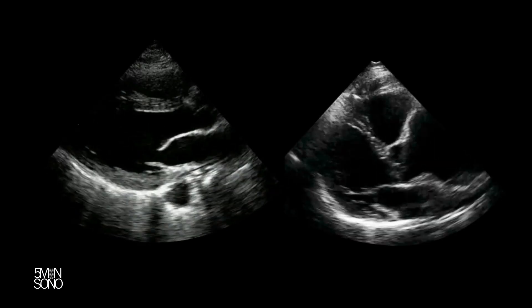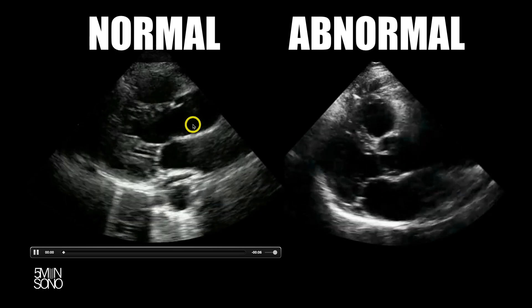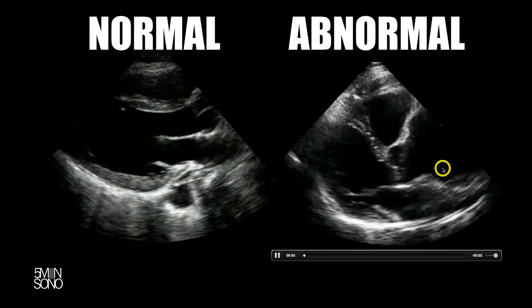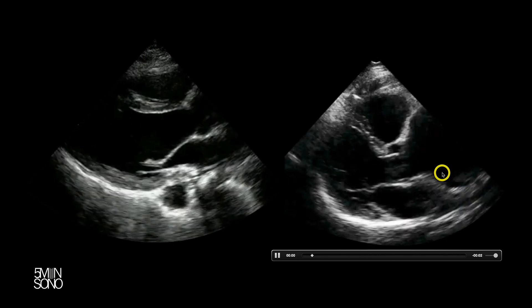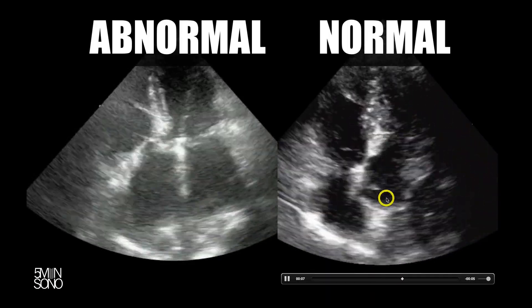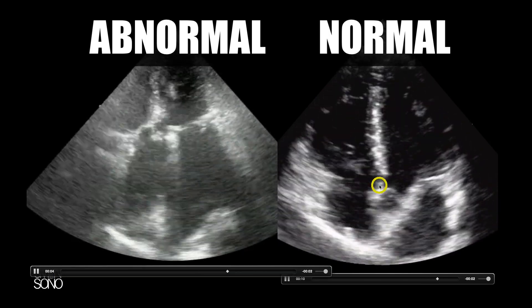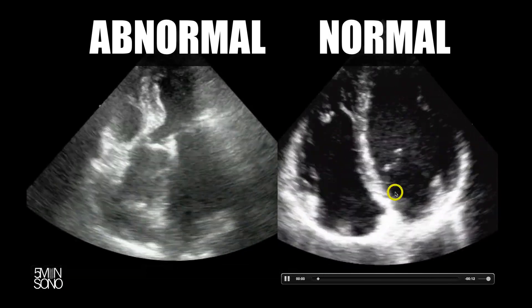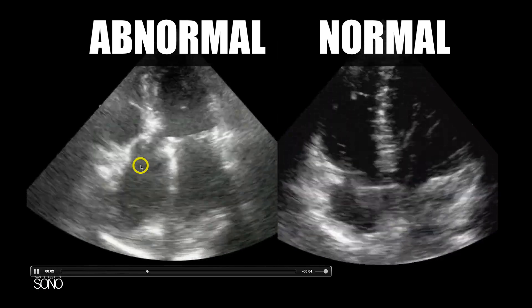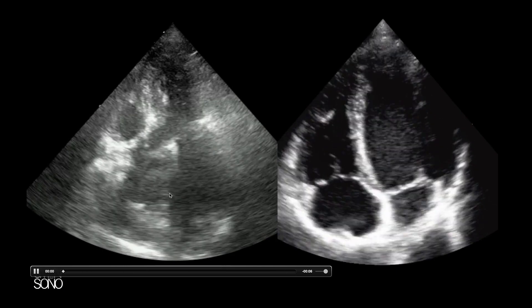Let's start with the thoracic aorta. We have a parasternal long axis view here, and you can see that this ascending aorta is just massive — really big aortic dilation. This is an apical five-chamber view. The fifth chamber right here is the aorta, and you can see this is normal — usually can't see a whole lot of it past the valve. Over here, we have an abnormally enlarged ascending aorta. It's actually about the same size as that left atrium.